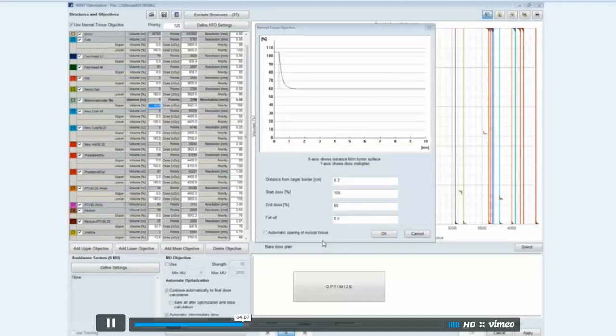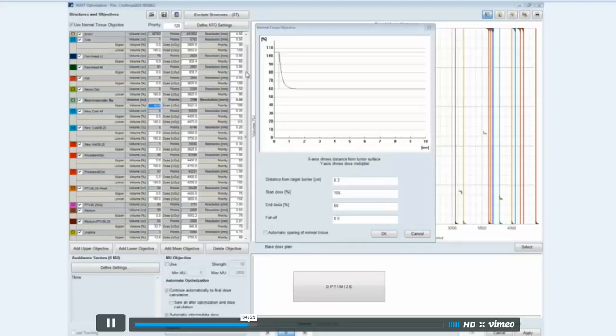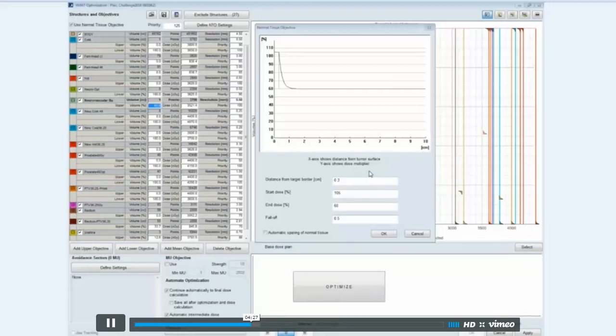I also use the intermediate dose calculation, and I feel like in most cases it helps cover for any differences between what the optimizer says we're going to get and what we get after calculation. Then I calculated my plan at 1.1 millimeters, I believe, calculation grid size.